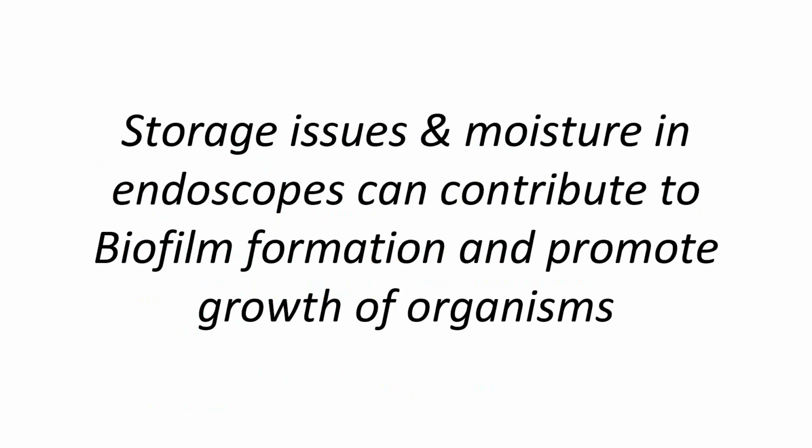And this is really an up-and-coming area that's having a lot of emphasis placed on it lately. We've never really thought in the past much about how dry our scopes are, but I think you'll see in the future, as more and more data is available, that these endoscopes really need to be dry prior to going into storage. And if not, we can set up that foundation for biofilm to form.